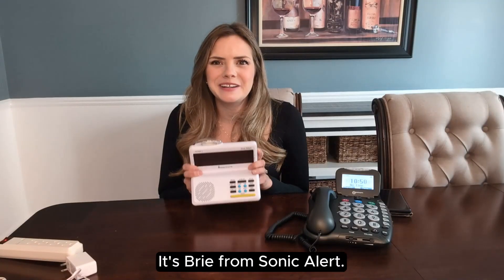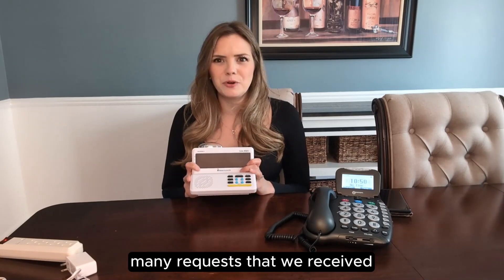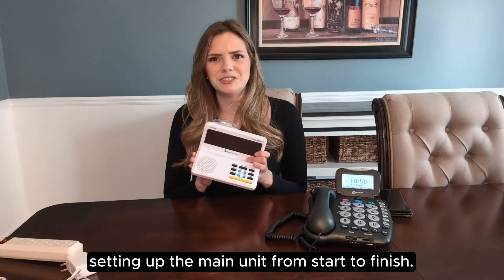Hi everyone, it's Brie from Sonic Alert. I'm here responding to the many requests we received for a HomeAware tutorial video setting up the main unit from start to finish.